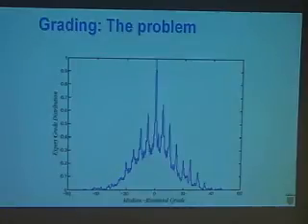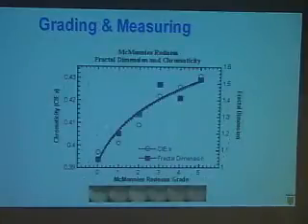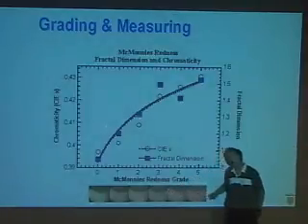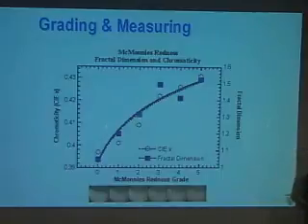And so we have a real measurement problem. So what do we do? Well, we can go away and use a variety of techniques to characterize the images in an objective way. So here's that top scale that you saw earlier. So this is a redness scale. And here are a couple of physical ways of characterizing the redness.